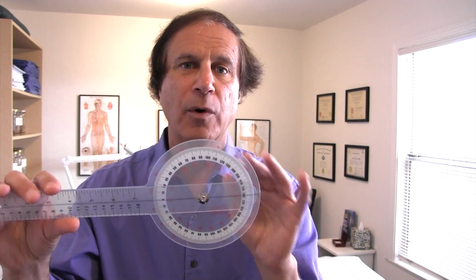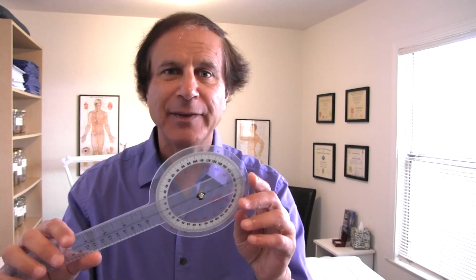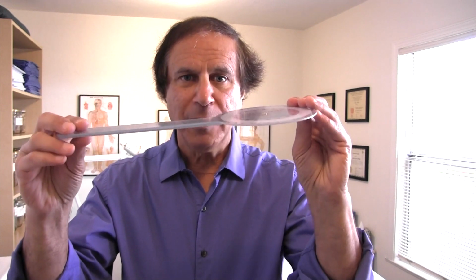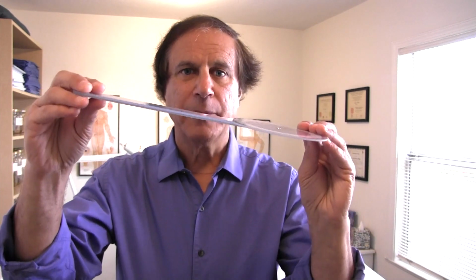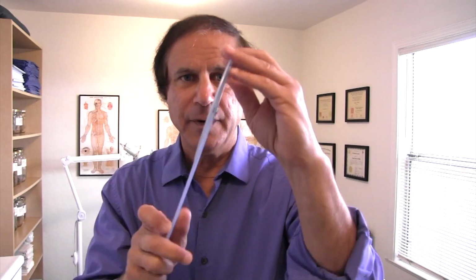I will tell you a key concept that very few people teach. When I used to teach orthopedic assessment at the chiropractic college for a clinic entrance exam, a concept that people loved was, think of ranges of motion as there's 6 planes, of course, 6 basic planes. You could argue there's circumduction, but let's not go there for now. So one plane is flexion, say with the neck. You bring the neck forward like this, that's flexion. Coming back is extension. And of course there's rotation, right and left, and then there's lateral flexion where you're tilting to the sides.